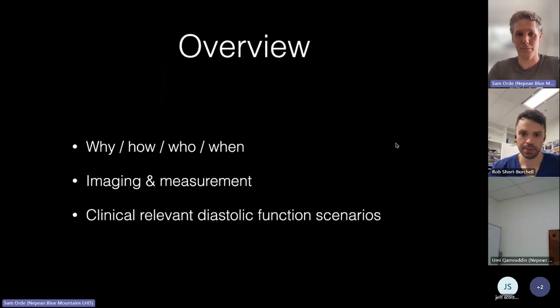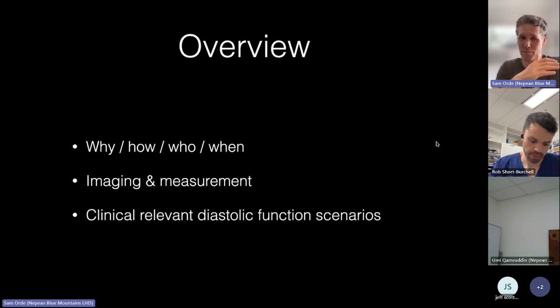Over the next 45 minutes, we'll talk about the why, how, who, and when to do diastolic dysfunction assessment. I'll particularly talk about how to do accurate measuring and the imaging, because that's really important. One of the things I hope I'll emphasize again and again is the importance of repeated analysis when we're trying to look at things like left atrial pressure estimation, and indeed we can use it for looking at things like preload responsiveness.